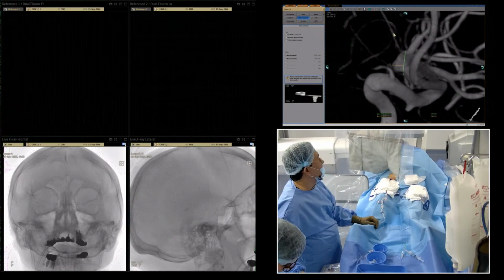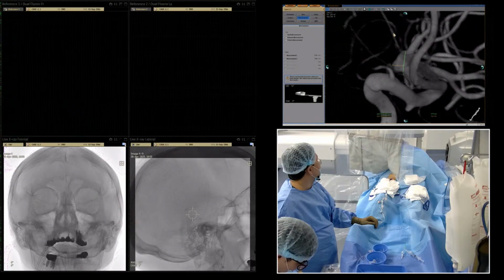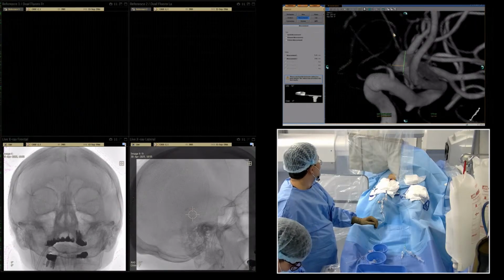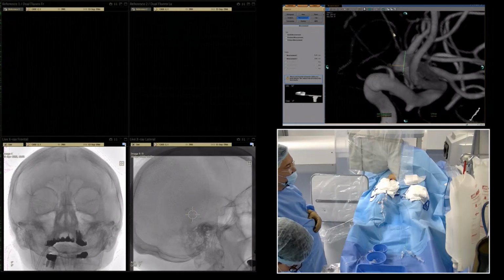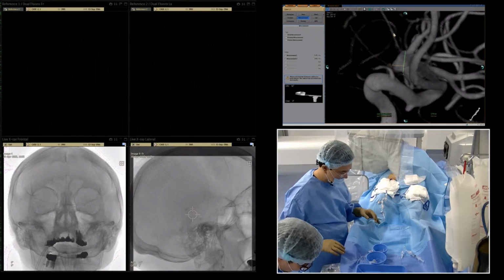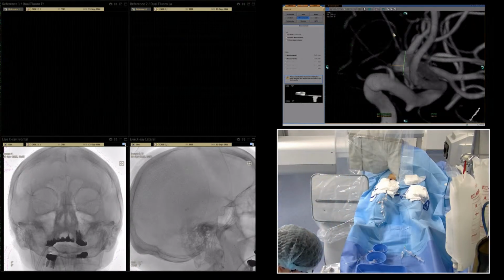92 left, it's 88 right. And then cranial 8 is a caudal 8. It's like in the mirror. Okay. Let's change for the link mode.